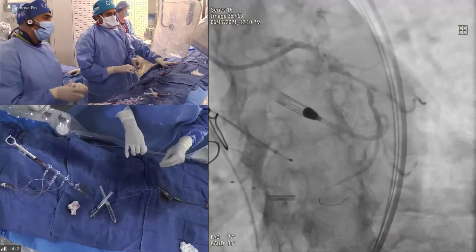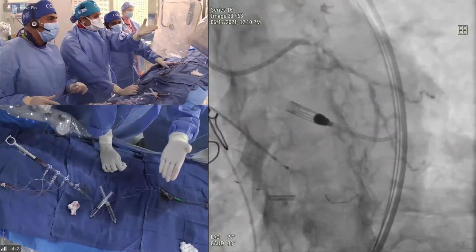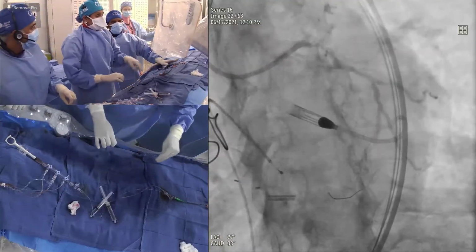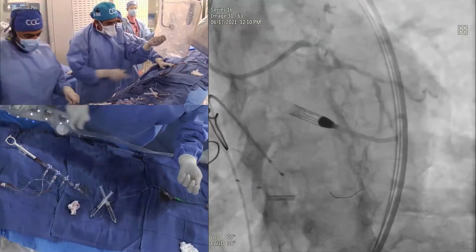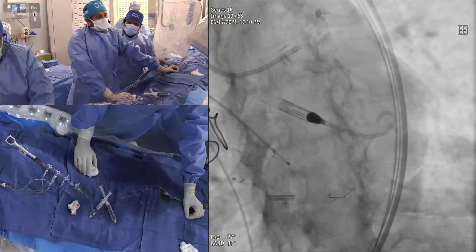Tortuosity to me, I think we already have 1.5. Do you see that? The vessel has opened up, there's a clear gutter. Okay. I think we will just balloon. The question is, burr-wise, you're done with 1.25. Do you upgrade it, or do you try to see if your balloon can open up the lesion, so then you don't need to upgrade it? I think that's reasonable.